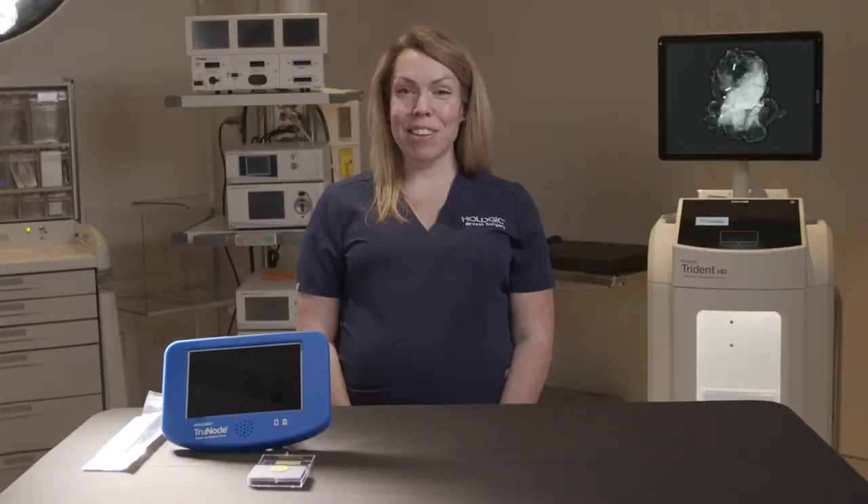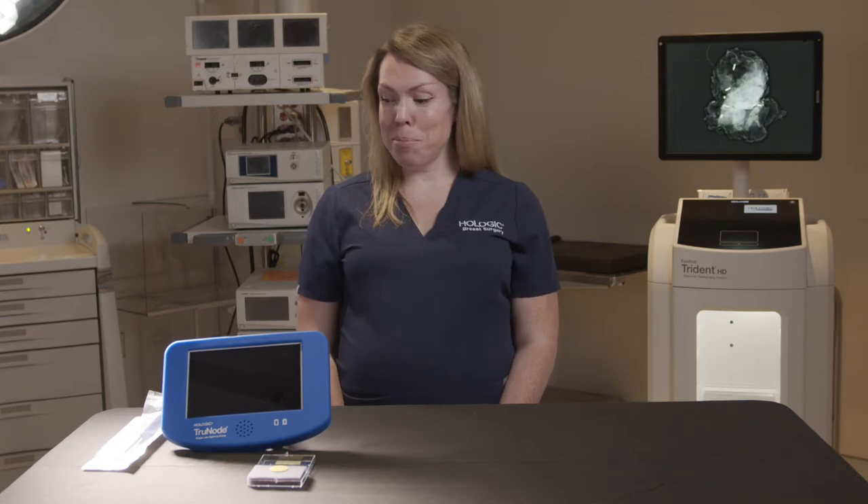Hi everyone, my name is Christina with Hologic and today we are going to be talking about the TruNode Gamma Probe, which is a single-use sterile gamma probe used for sentinel lymph nodes and radioactive seeds.